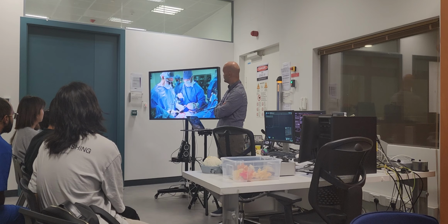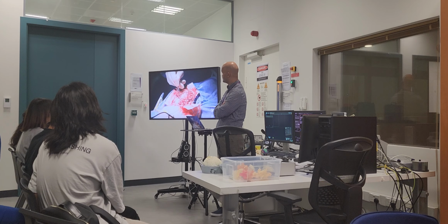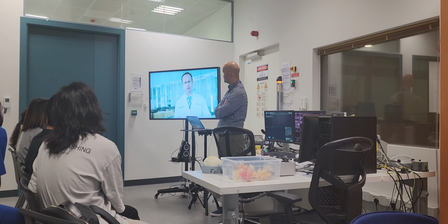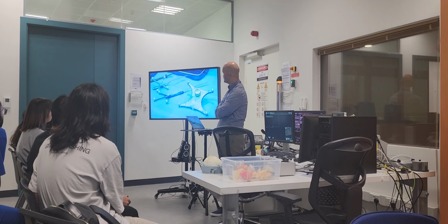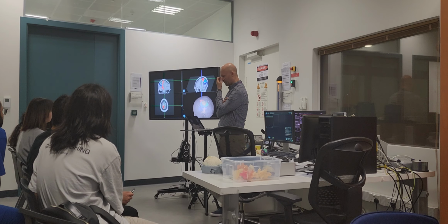But the moment the brain is exposed, we have to start mapping the surface of the brain to identify the function. We basically bring together the information derived from the functional MRI imaging and from the pre-surgical assessment onto the patient's brain in that situation. Basically, every single instrument I can use, I can navigate with the help of the most modern equipment we have, so that at any given time during the case, I know exactly in which area of the brain I am.